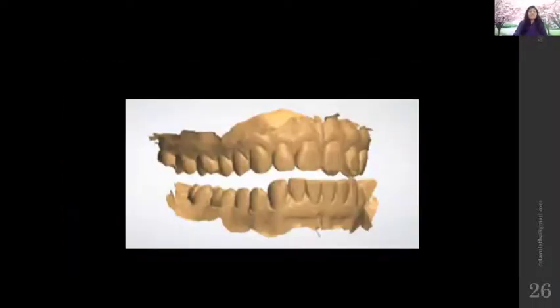So what is dental or model VTO? In this case, if we have a class 2 malocclusion like this, we would check from the lateral view. We bring the mandible forward like this, and we check for improvement in the occlusion. We also check the improvement in the anterior section, whether the deep bite is corrected, whether the overjet is corrected, whether the molars are in class 1, whether the canine is going to fall in class 1.